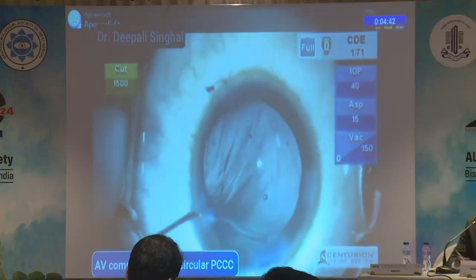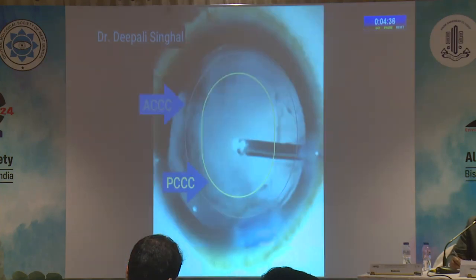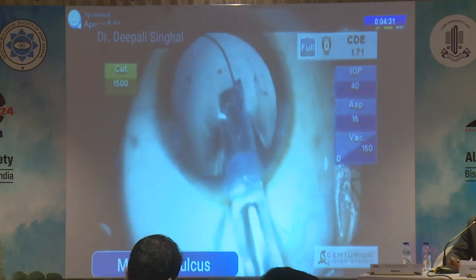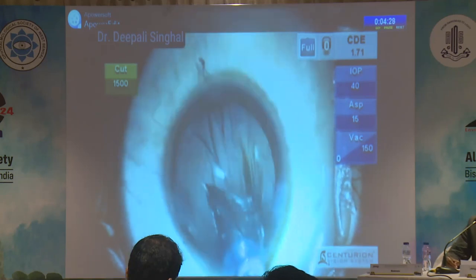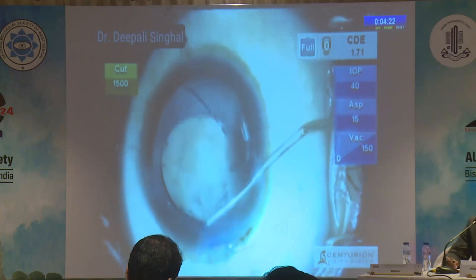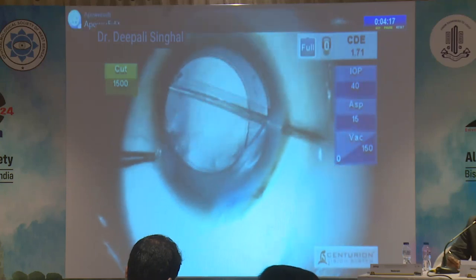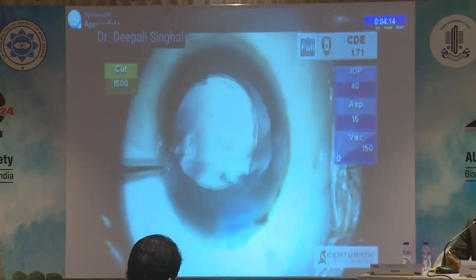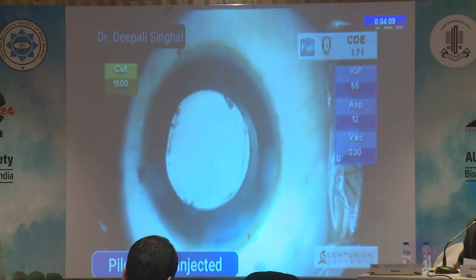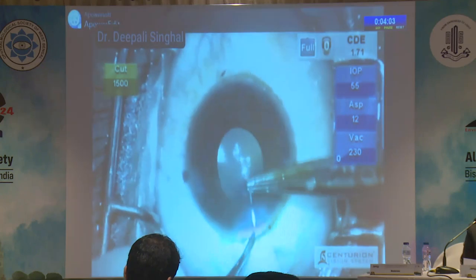Sulcus was formed with viscoelastic. A circular PC defect was seen with an irregular anterior capsulorhexis, and a three-piece IOL was placed in the sulcus, with haptics rotated over the area of maximum anterior capsular rim. Pilocarpine was injected. Main port was sutured.